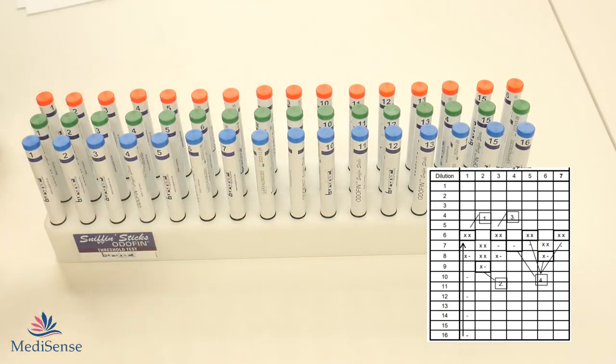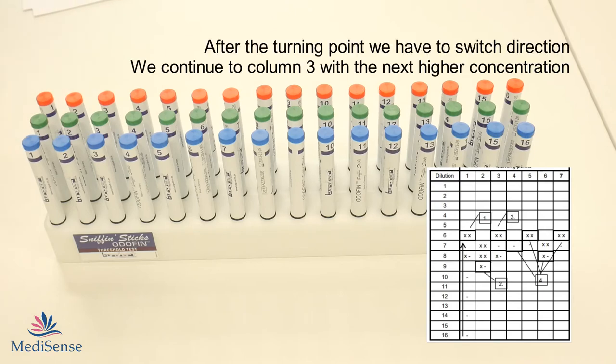When going up or going to the lower concentration you go on until the test person does not identify the target pen. In the example this is the sticks with number 9.